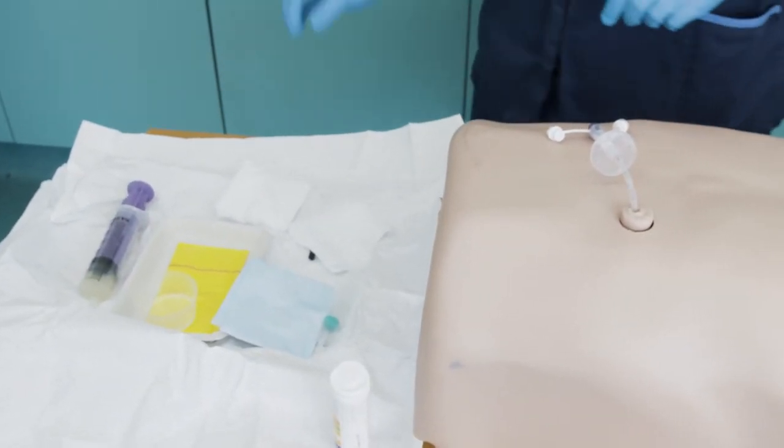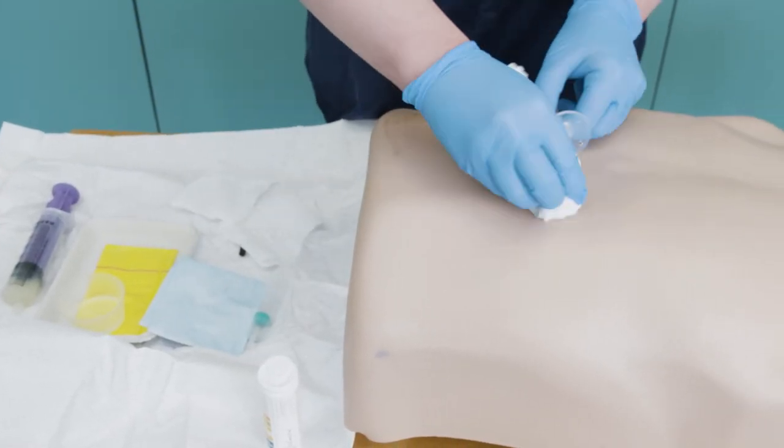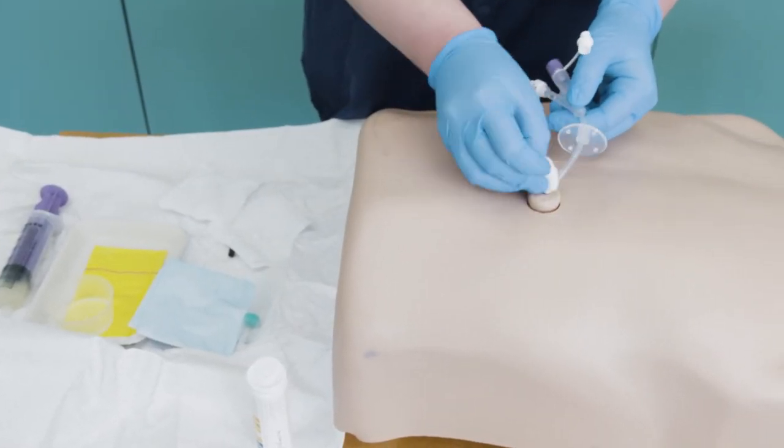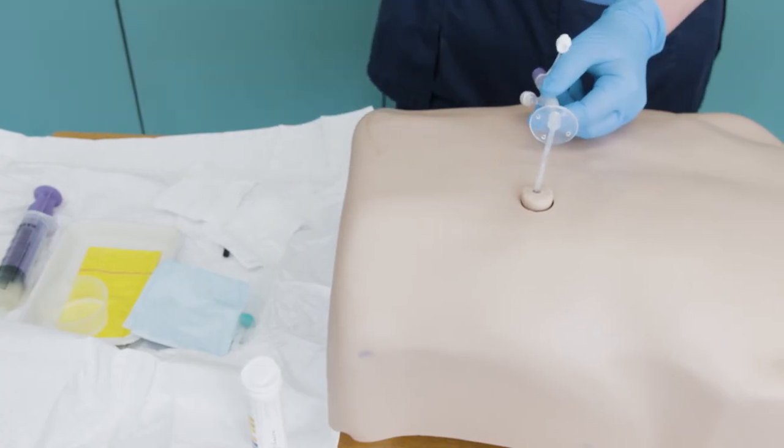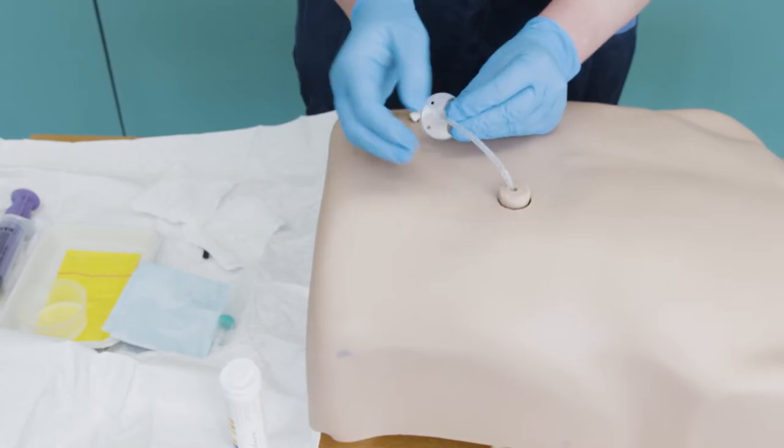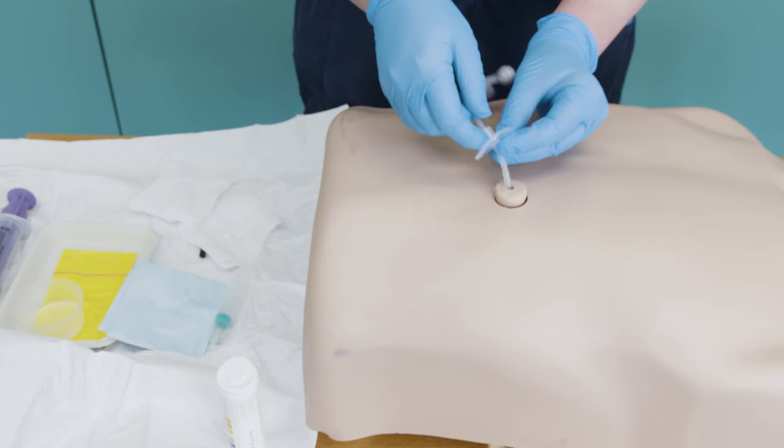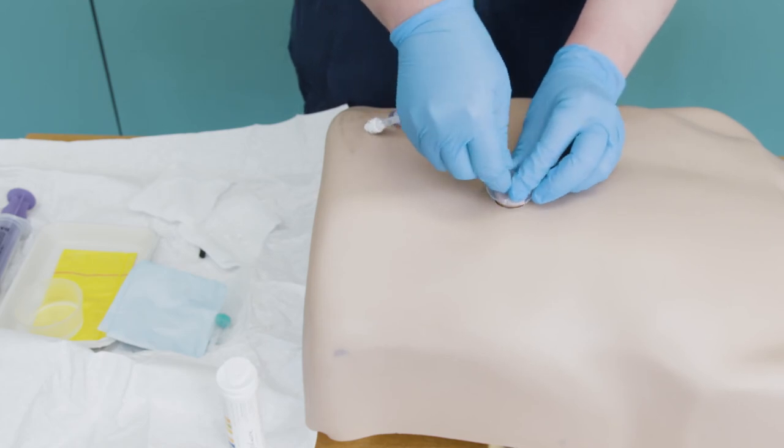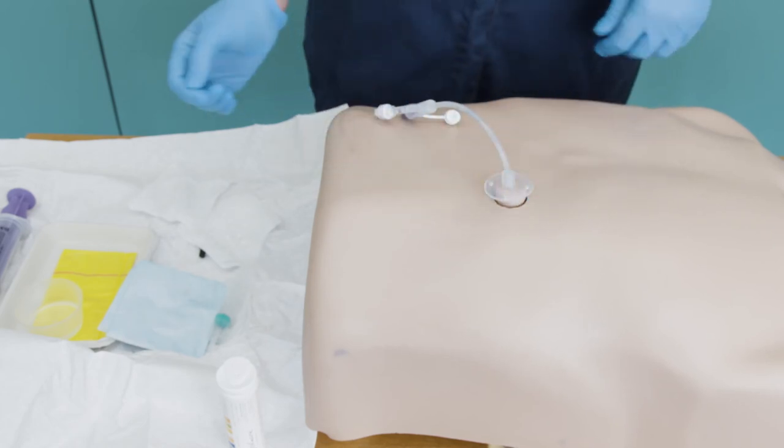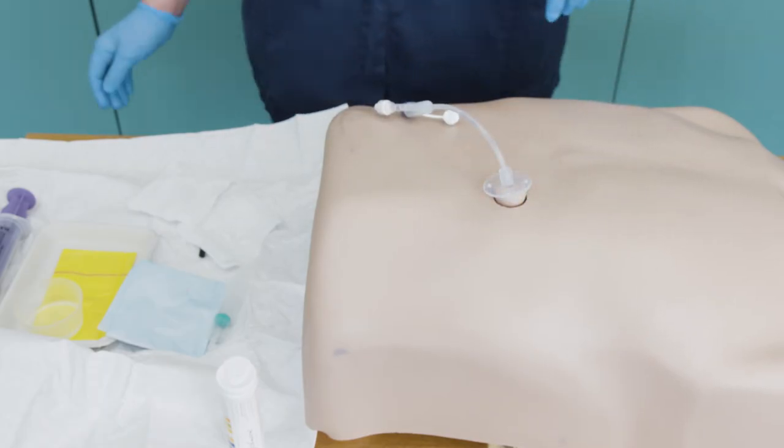Wipe the skin and the tube using gauze. Gently pull the gastrostomy tube back until there is slight resistance from the internal balloon touching the stomach wall. Secure the tube according to the manufacturer's instructions by sliding the external retention disc so that it is at least 2mm from the skin surface, but ensuring that it is not too tight or too loose.